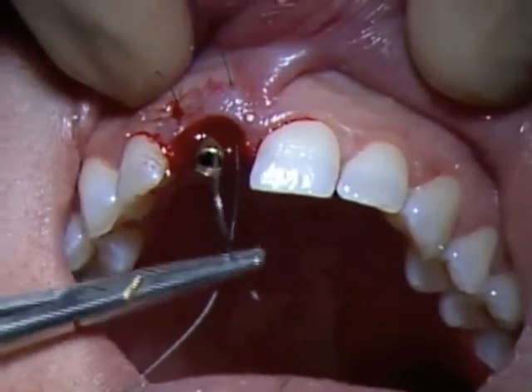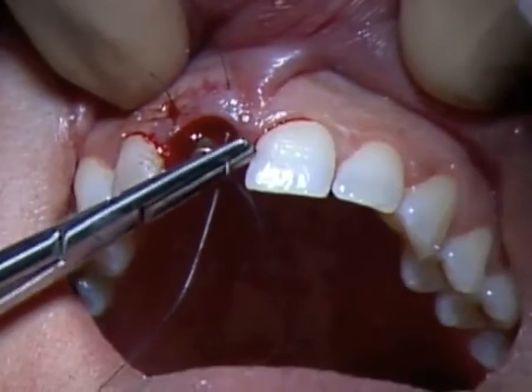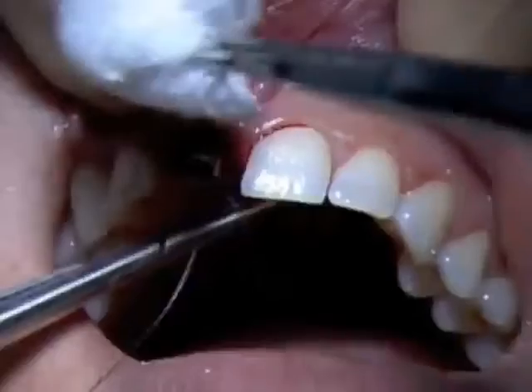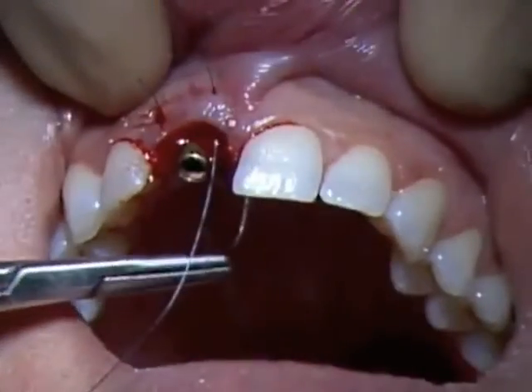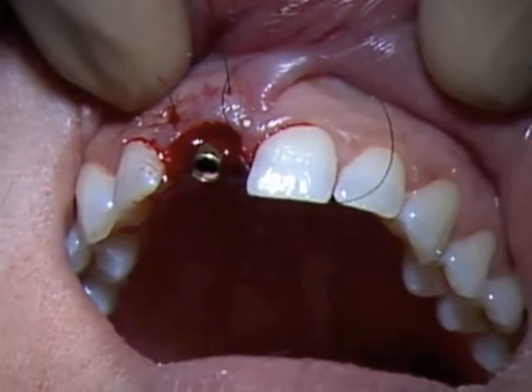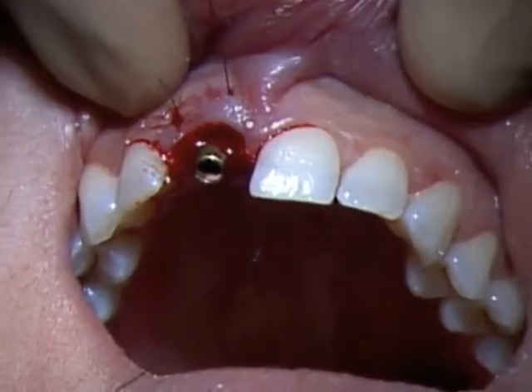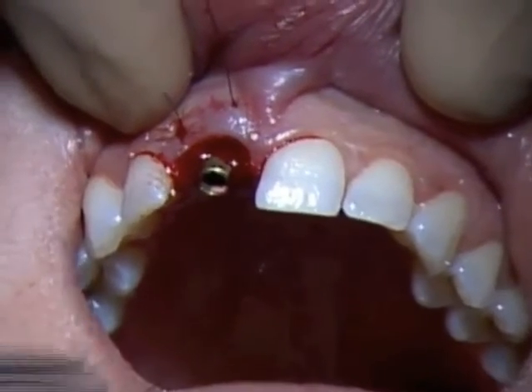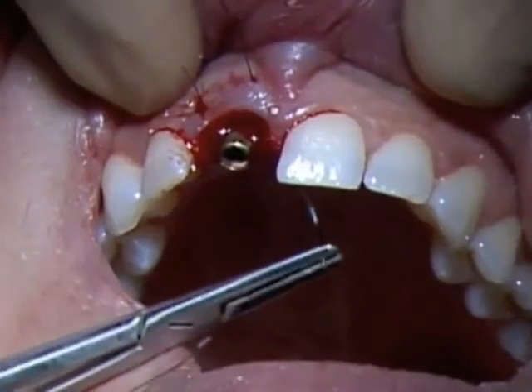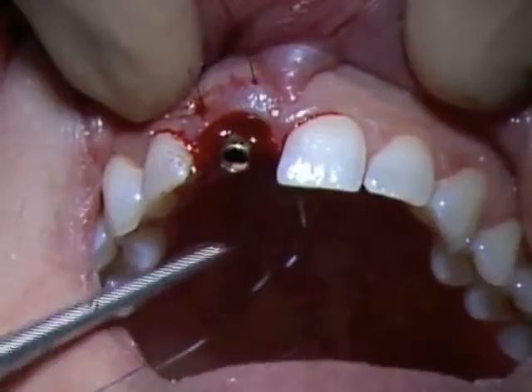And we will go out deep in the palate in order to have a wide base and a more stable suture. We do not like to suture conventionally in this region over our papillas because we tend to push them up. With these 2 mattress sutures, we will be able to stabilize and seal the area in a preferable position.